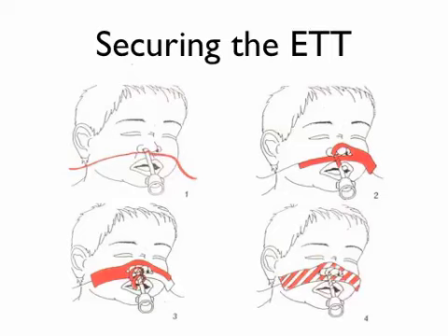I think I didn't mention that before you start with the tapes, you want to get the Fry's balsam or the tinc benz and put that on the top lip and on the nose and the bits on the cheek, just to help the tapes stick firmly to it. And sometimes you also get some pieces of Comfeel or DuoDERM, about a couple of centimetres long, for each cheek, just to go under the string so that it doesn't cut in too much or cause any problem with the skin on the cheek there.